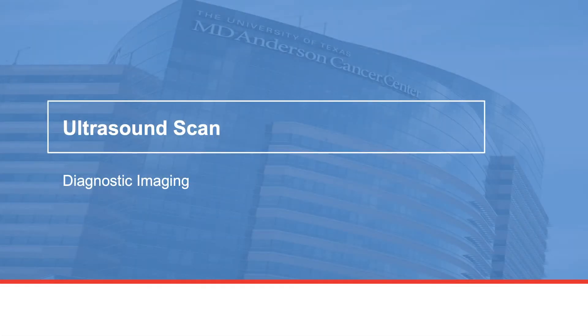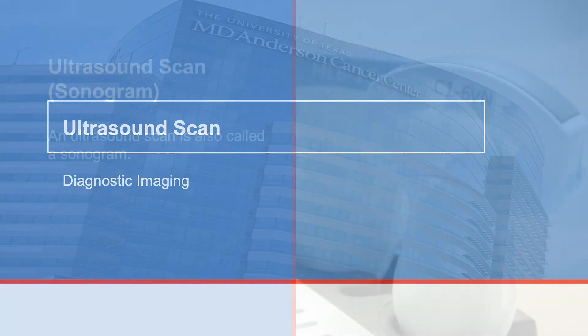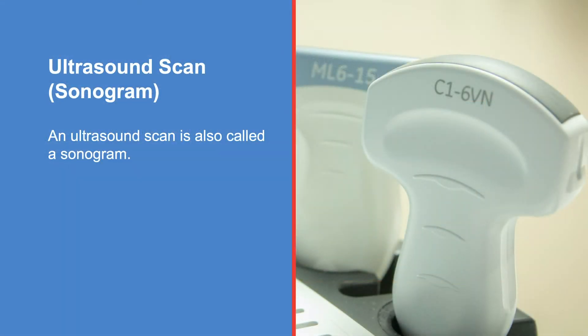Welcome to the Diagnostic Imaging Center. This is where you will receive an ultrasound scan, also called a sonogram. It is a diagnostic test that uses high-frequency sound waves to create an image of your internal organs and structures. The ultrasound scanner has a device called a transducer that sends out sound waves and receives the echoes as they bounce off structures within your body. The echoes create an electronic image that can be seen on a monitor. The images will help your doctor with making a diagnosis.